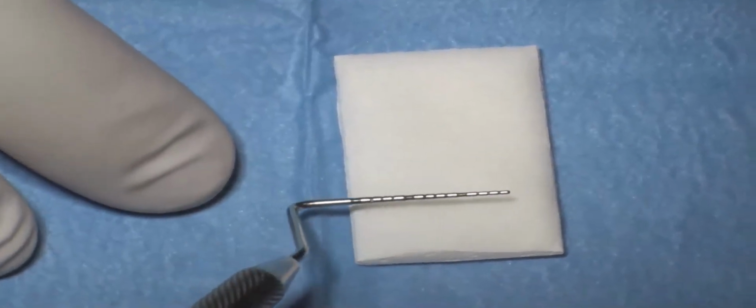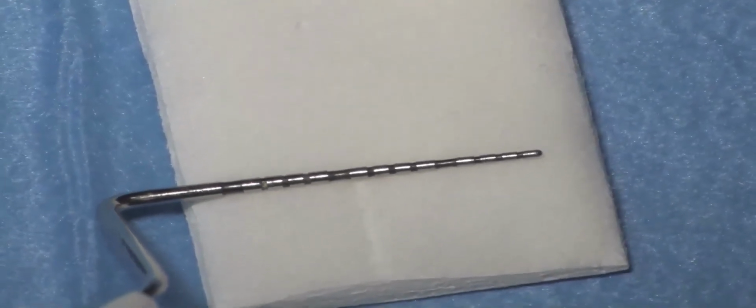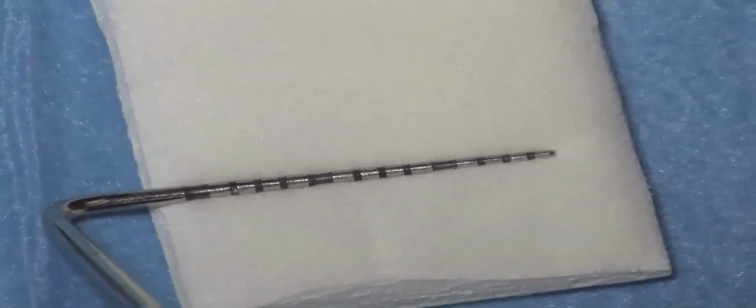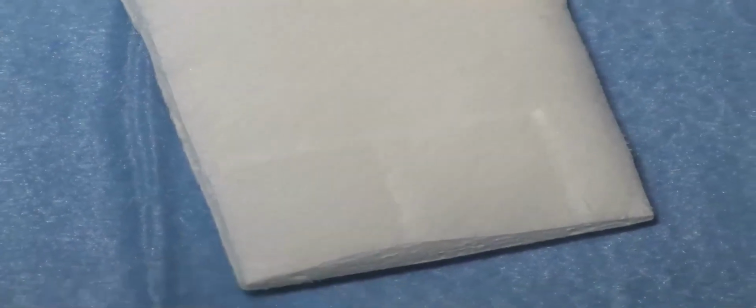Okay? We said we will take about 7 millimeter height because the gingival recession are quite small. And we set about 18 millimeter long, so more or less in this direction. So we mark the area that has to be cut. 15.